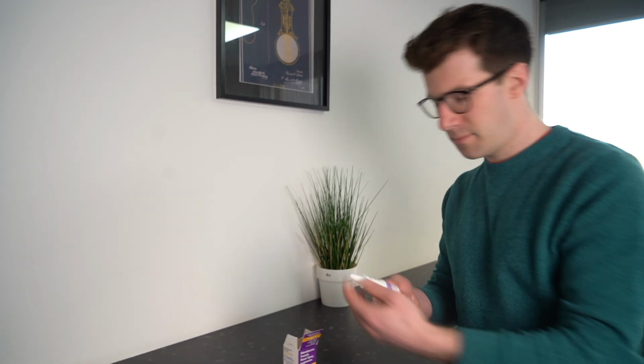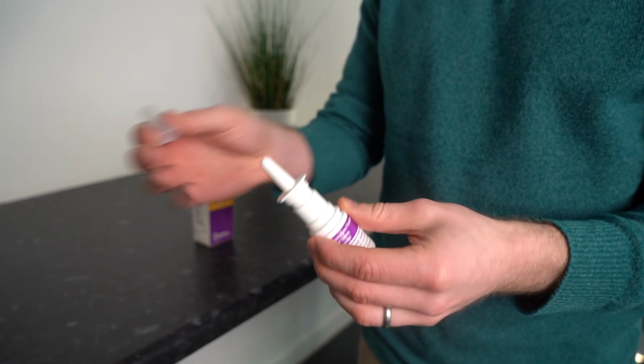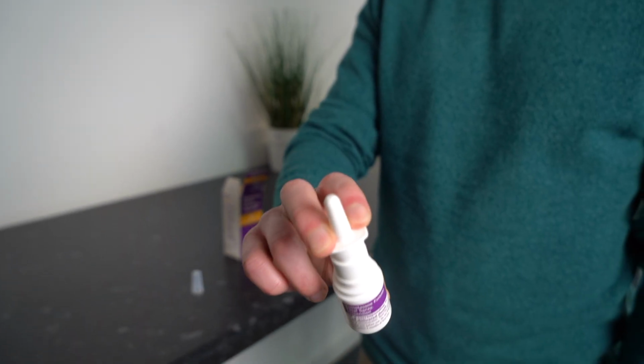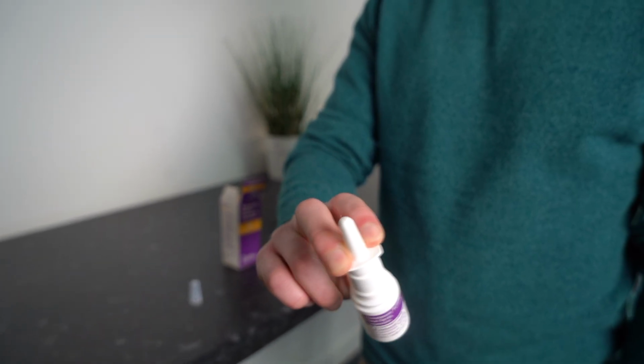So first of all, take the dispensing bottle out of the pack. Shake the bottle a couple of times before using it. Next, you want to remove the dust cap. This is the cap that is covering the nozzle. If you're using the bottle for the first time, you need to prime it by pumping the spray 10 times until a fine mist-like solution such as this is produced.